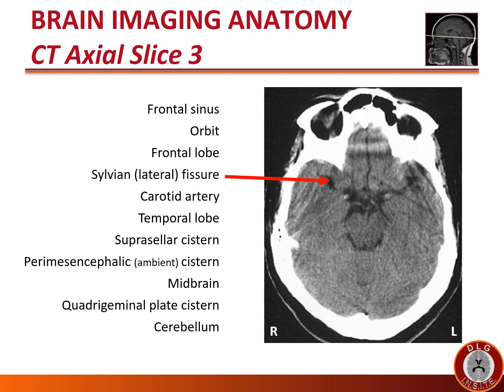The sylvian or lateral fissure, as it is sometimes called, is the largest fissure in the brain. At the level of this slice, it separates the frontal lobe anteriorly and the temporal lobe posteriorly. The middle cerebral artery runs in the sylvian fissure. Here you see the relatively hyperdense carotid artery in the circle of Willis. The temporal lobe lies posterior to the sylvian fissure. Note also the very medial temporal lobe forms a little knuckle protrusion sometimes called the uncus.